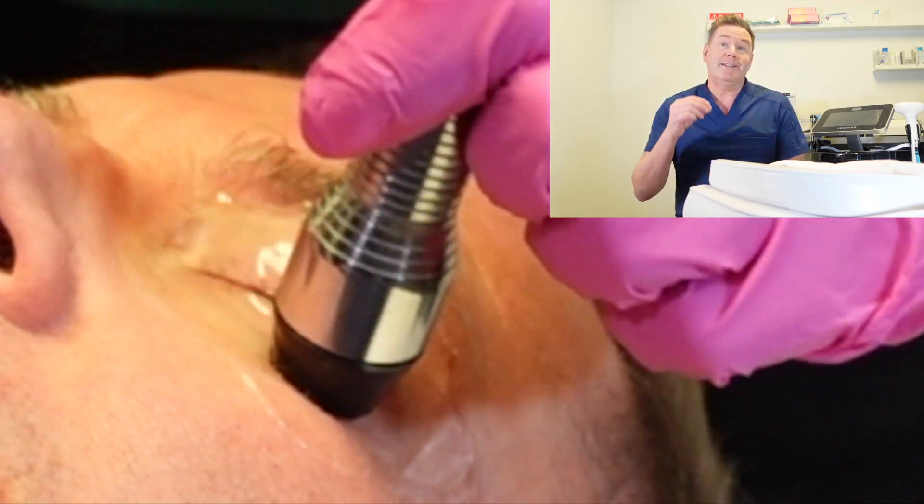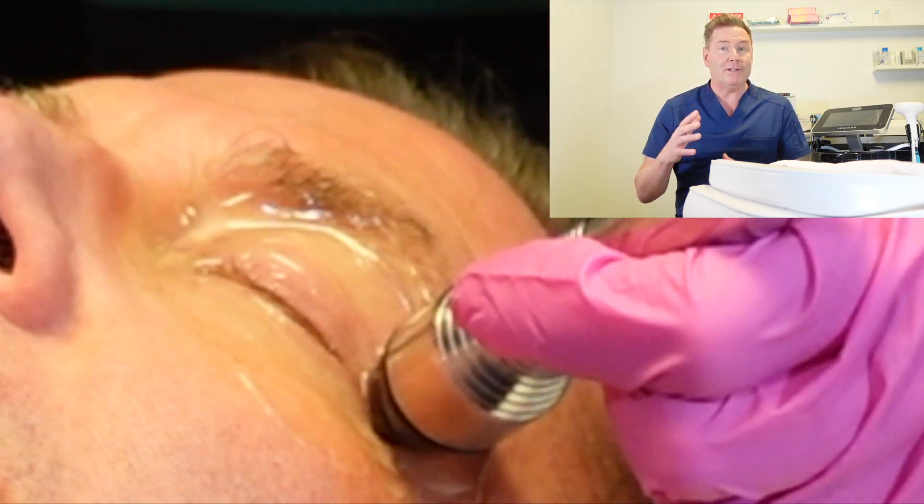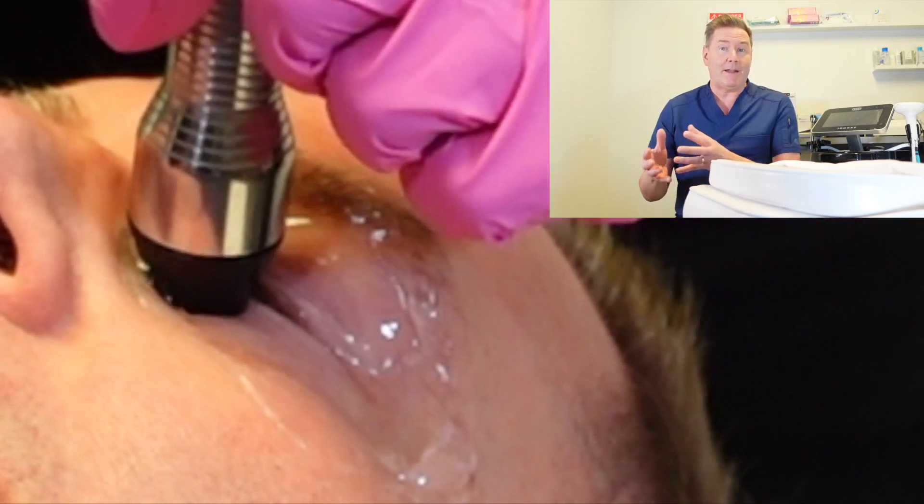Then the ocular hygienist is going to gently glide that probe around your upper and lower lids and around the areas around your eye to heat up that tissue.